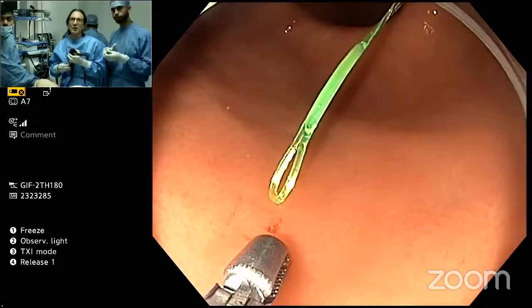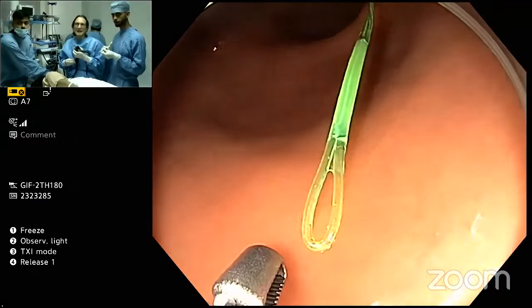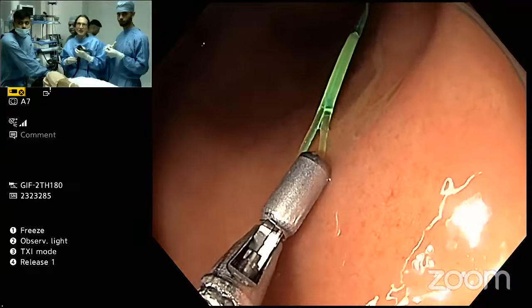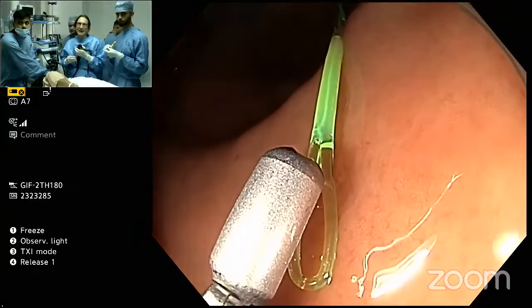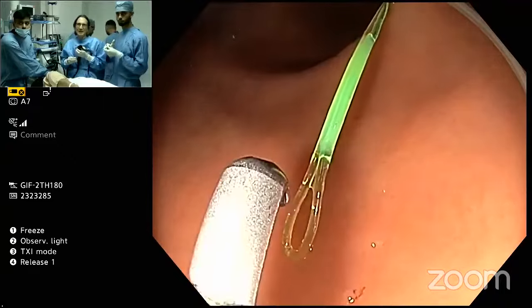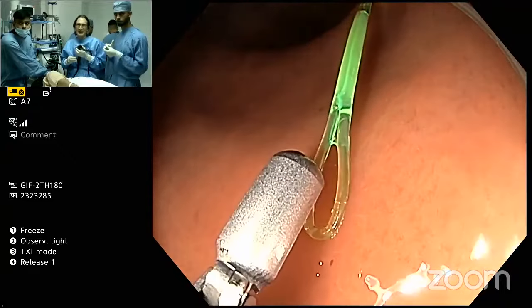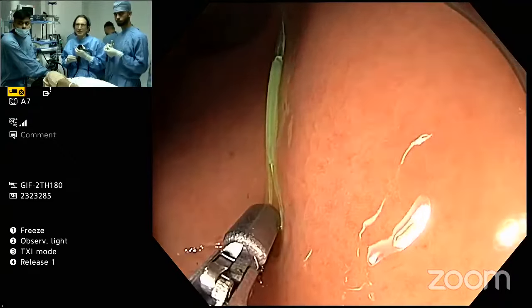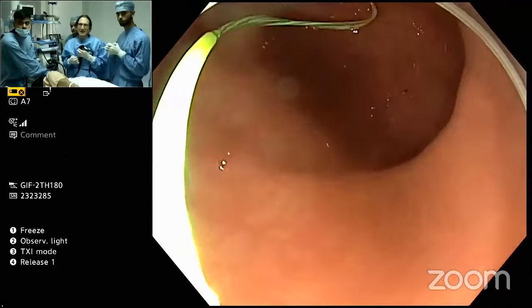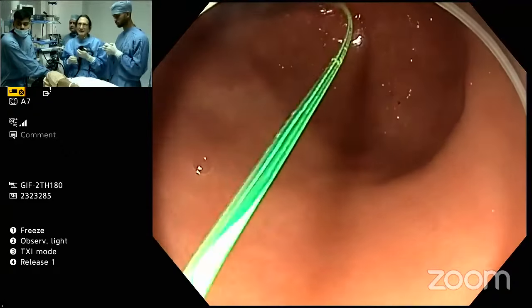It's a little difficult because these graspers are so thick. Open. We have one that's a little thinner, but you can see it can be a little challenging to get it in there like that. In the teeth. Close. Oh, see, I missed it. Open. And you could spend like an hour doing this. Close. Okay. I think I got it. Okay, one second. And then it just has to pull in like this.